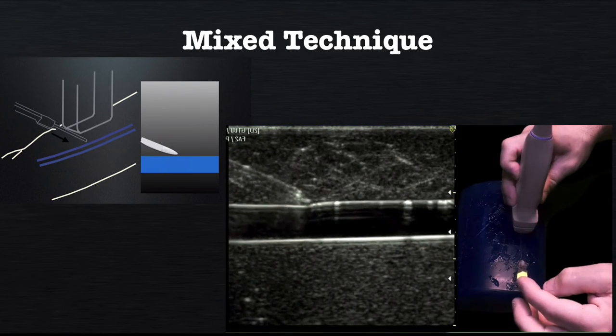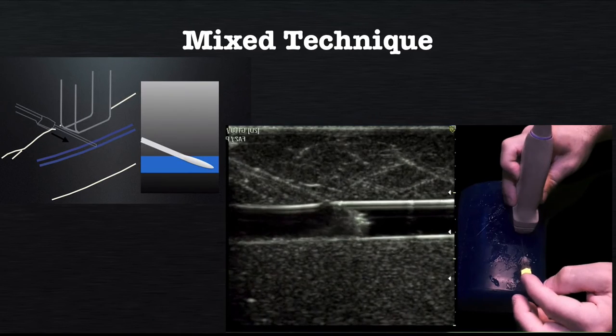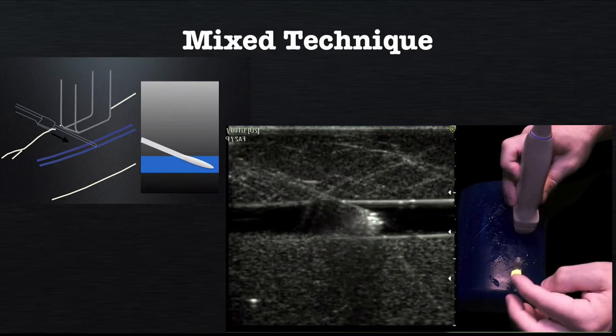Once we visualize the vein and the needle in long axis, we can insert the needle into the anterior wall of the vein and avoid a posterior penetration.